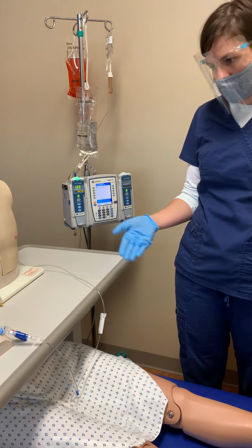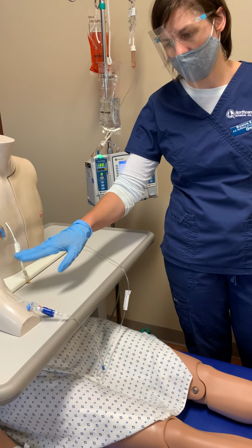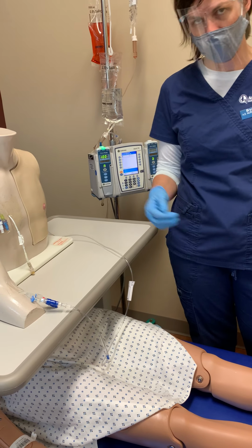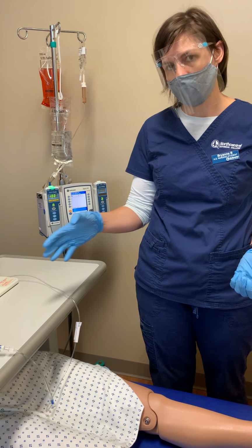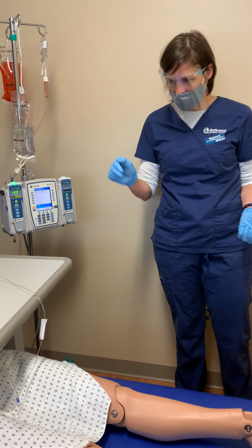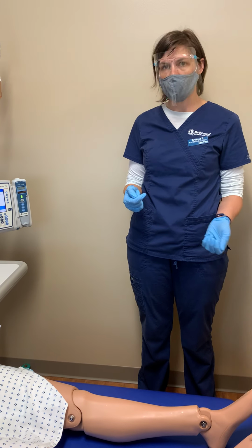Since it was already running, I didn't, but I'm looking now and I see that there's no redness, no inflammation, no warmth, and the patient hasn't made any complaints about that IV site. But I would always be keeping an eye to make sure that it still looked like a good viable line. So now that I have that potassium running, I'm going to move on and get Frances more comfortable and deal with that pain.